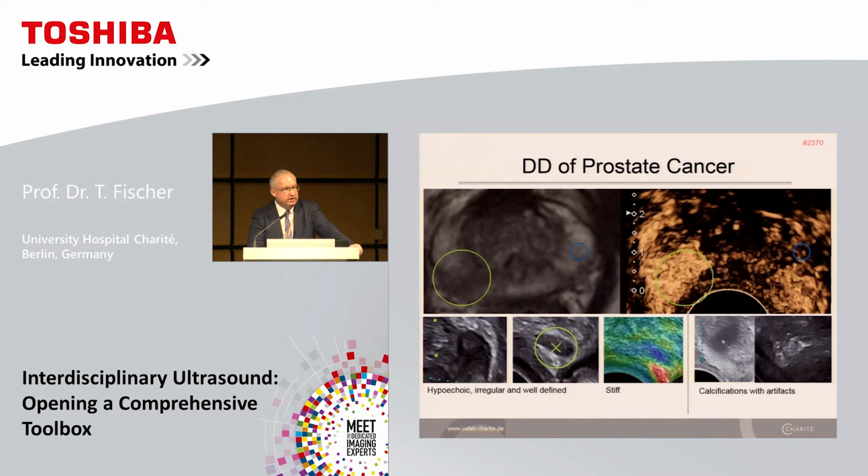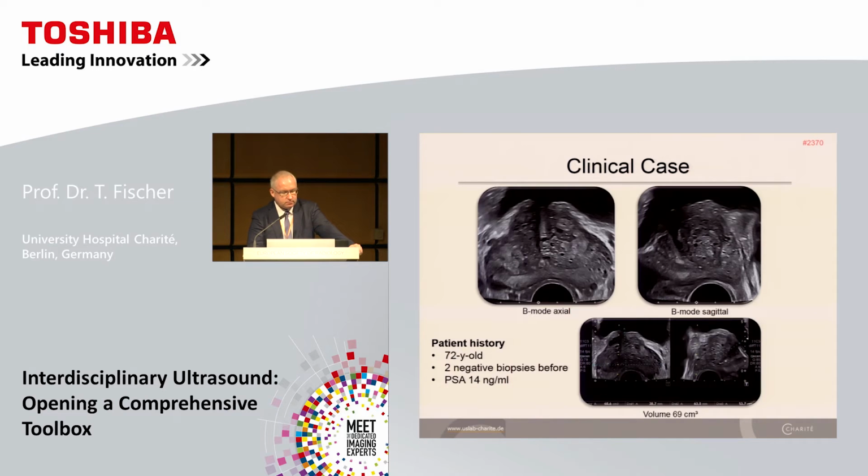But look at this, if we deal with contrast application in the fusion mode, you can see beautifully here this multifocal prostate cancer, much better than with the visualization in the MR scan, in my opinion.